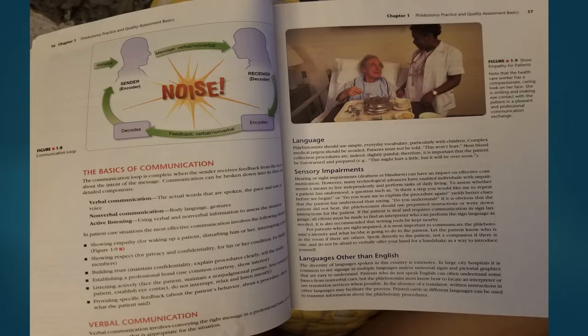Languages other than English. The diversity of language spoken in this country is extensive. In large city hospitals, it is common to see signage in multiple languages and/or universal signs and pictorial graphics that are easy to understand. Patients who do not speak English can often understand some basics from nonverbal cues, but the phlebotomist must know how to locate an interpreter or use translation services when possible. In the absence of a translator, written instructions in other languages may facilitate the process. Printed cards in different languages can be used to transmit information about the phlebotomy procedure.